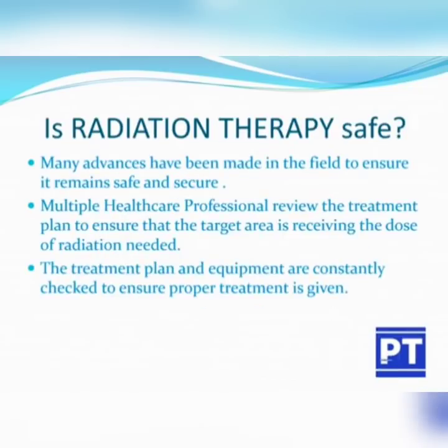Is radiation therapy safe? Many advances have been made in the field to ensure it remains safe and secure. Multiple healthcare professionals review the treatment plan to ensure that the target area is receiving the dose of radiation needed. The treatment plan and equipment are constantly checked to ensure proper treatment is given.